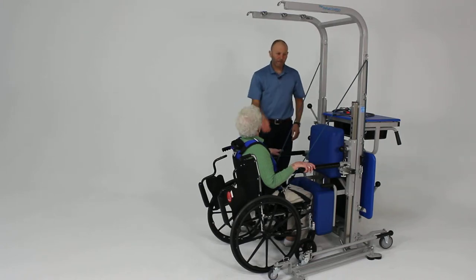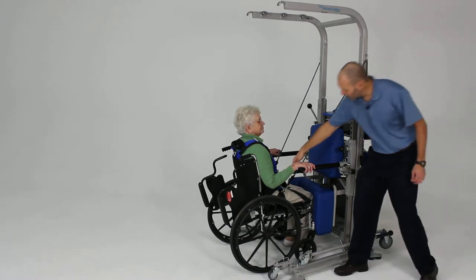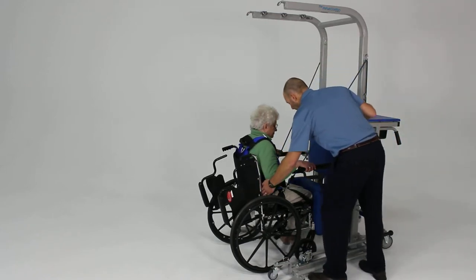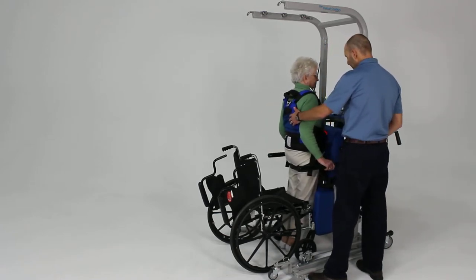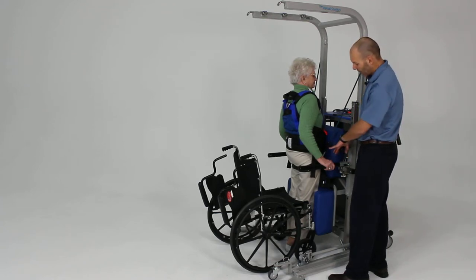That's going to provide assistance in the sit-to-stand motion, angled to bring the hips into extension. We'll have you lean forward and go ahead and stand up. Good. Now once she's in the standing position, come a little farther forward so your knees are against the pad — now she's safely blocked at her knees.